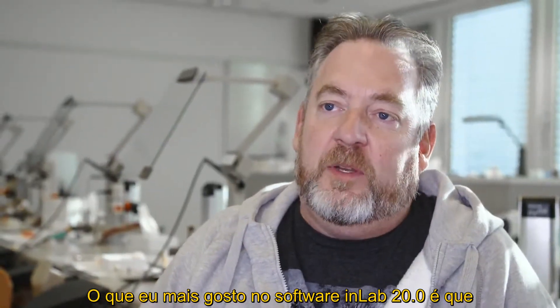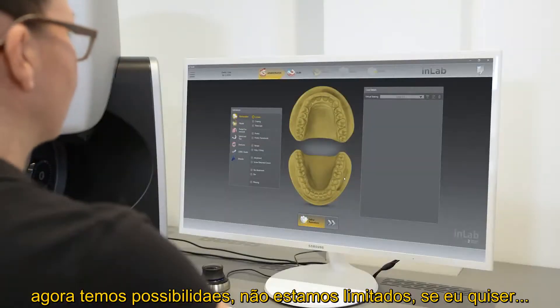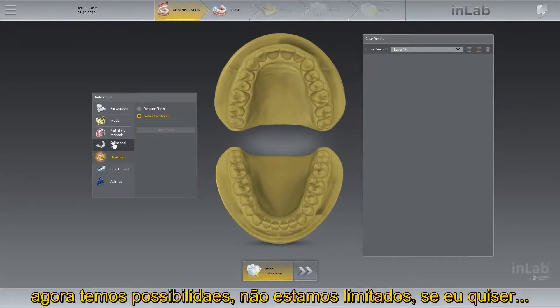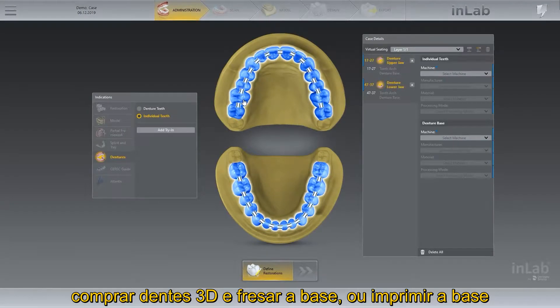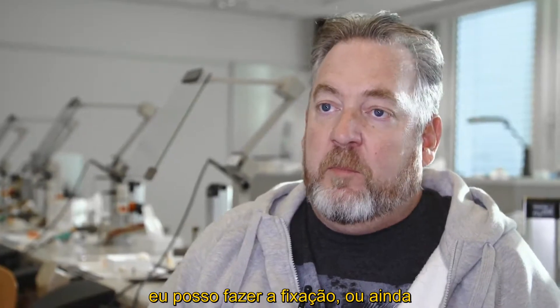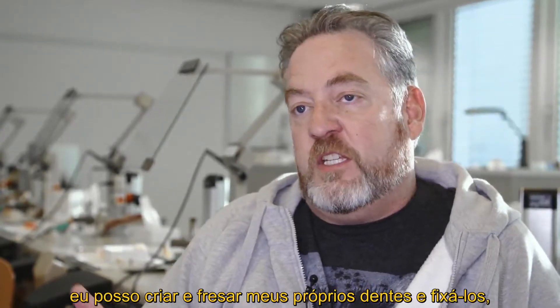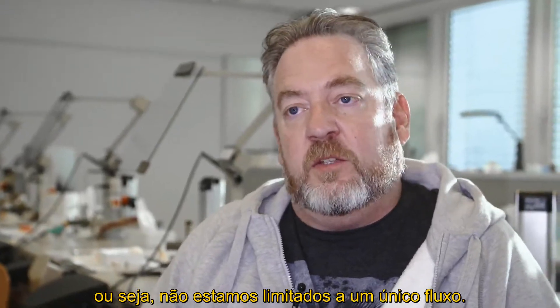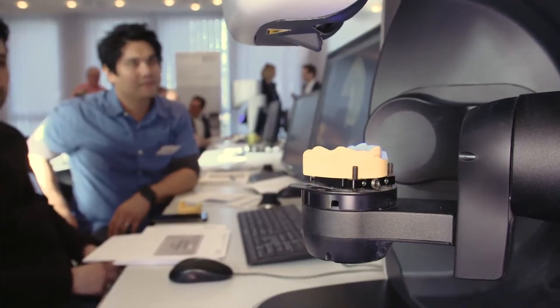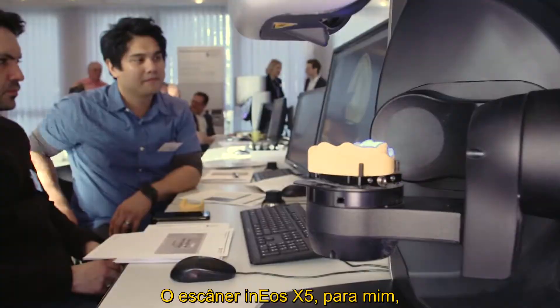With the inLab 20 software, what I really like is that we have the ability to not be limited. If I wanted to purchase 3D teeth and then mill or print out the base, I'm able to bond those together. Or if I want to design and mill out my own teeth and bond that way, we're not limited to one method.